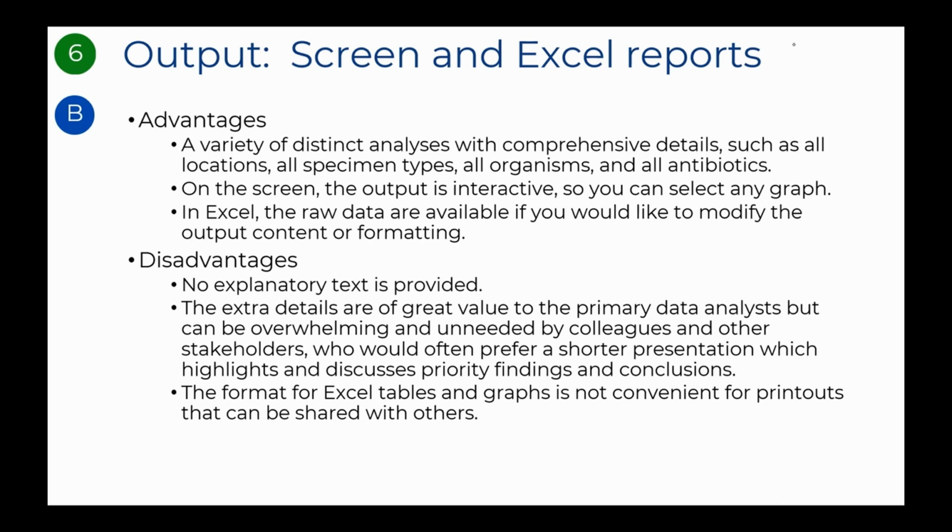For reports that were optimized for display on the screen or export to Excel, there are a number of advantages. There is a variety of distinct analyses with comprehensive details, such as all locations, all specimen types, all organisms, and all antibiotics. On the screen, the output is interactive, so you can select any graph. In Excel, the raw data are available if you would like to modify the output content or formatting.